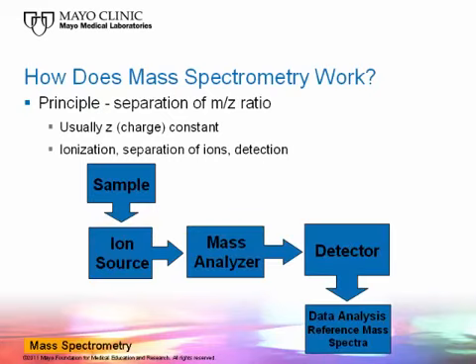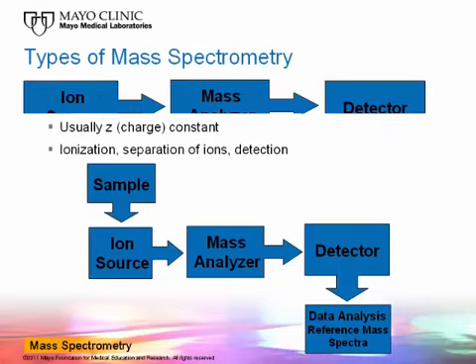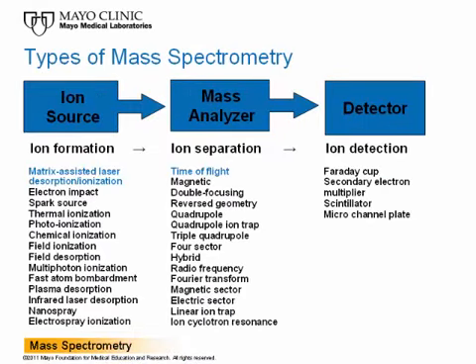Mass spectrometry measures particles based on their mass-to-charge ratio. To do this, a sample, in the described method the whole organism, is exposed to an ion source and its particles, in the described method proteins, are ionized, separated based on their mass-to-charge ratio, detected, and then the generated mass spectrum is compared to a library of mass spectra. Mass spectrometry requires an ion source, mass analyzer, and detector.